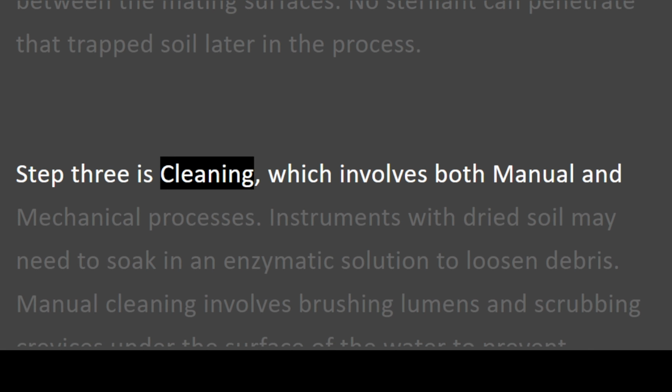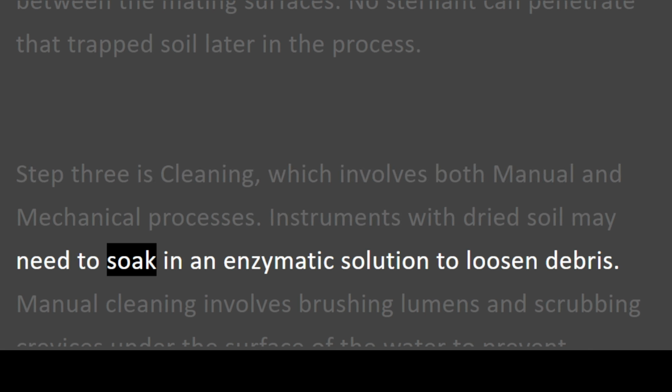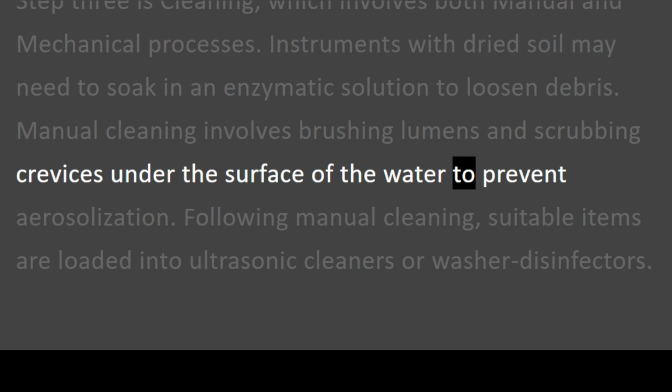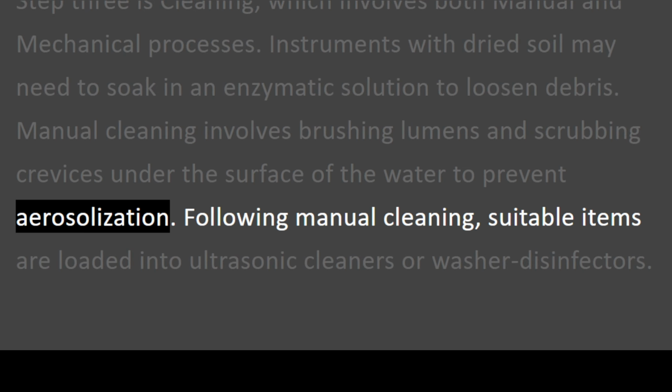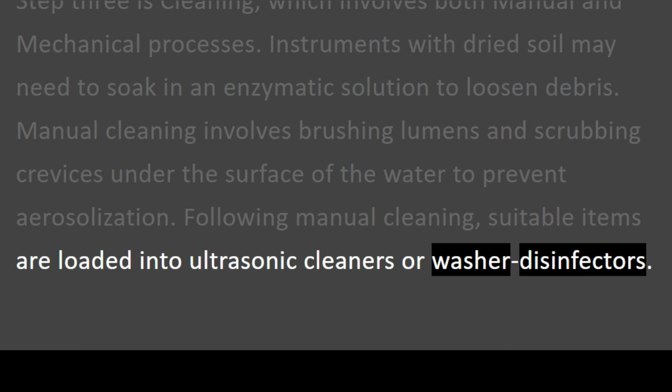Step 3 is cleaning, which involves both manual and mechanical processes. Instruments with dried soil may need to soak in an enzymatic solution to loosen debris. Manual cleaning involves brushing lumens and scrubbing crevices under the surface of the water to prevent aerosolization. Following manual cleaning, suitable items are loaded into ultrasonic cleaners or washer disinfectors.